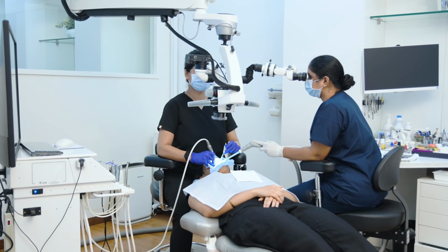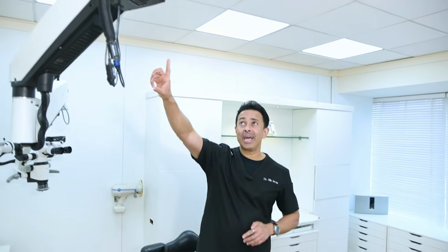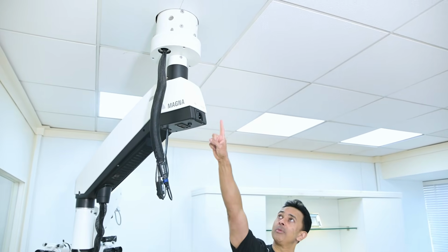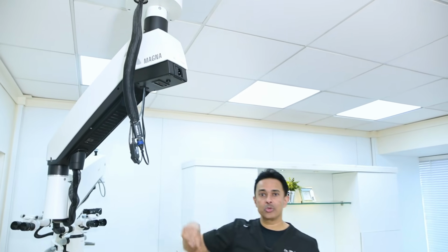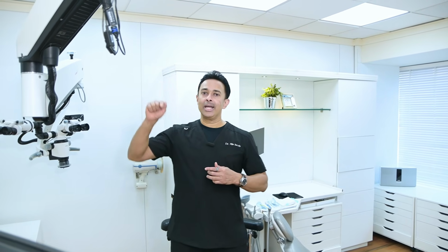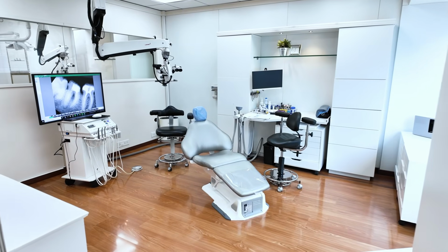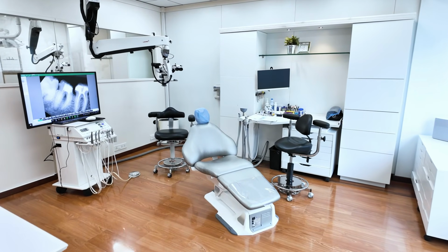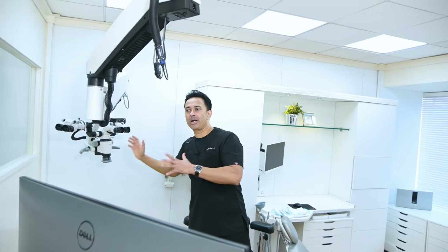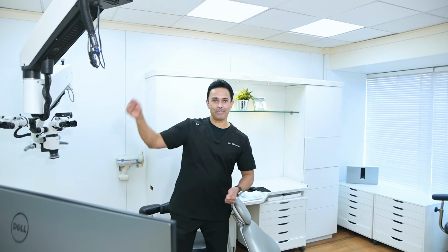And the other reason why this operatory appears far roomier than it is, is that we have planned where to mount the microscope. Because remember, the microscope is this huge tool and you can't just bring it into an existing operatory and plug and play. You have to plan it. You have to know how it interacts with the rest of the components here. And if you see here, we have planned it and put it as a ceiling mount, and we have installed it in a particular position so that it's very easy for us to bring it from a parking position into a working position. And once we have done working, we know how to park it back. It's not a big effort.